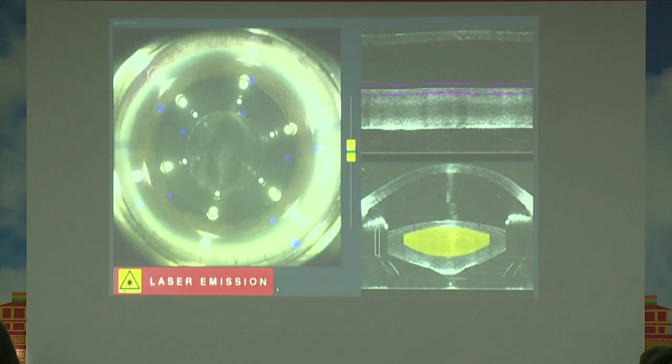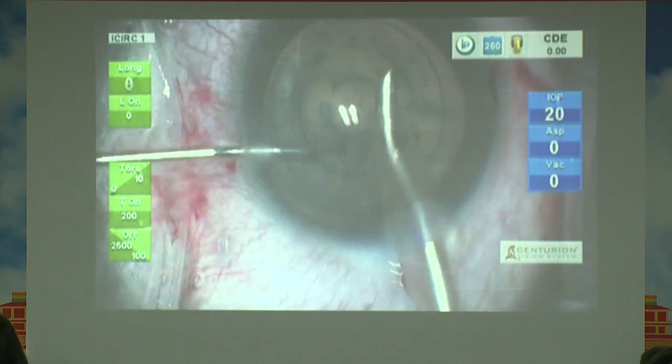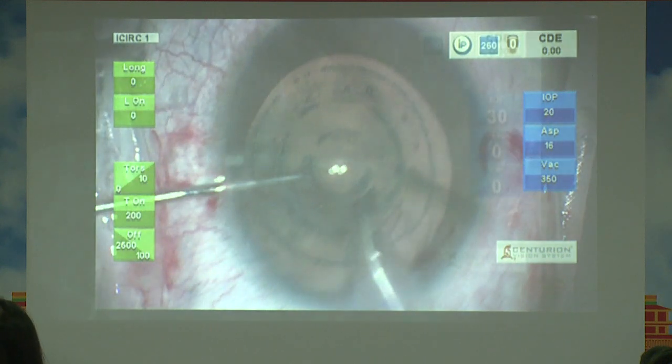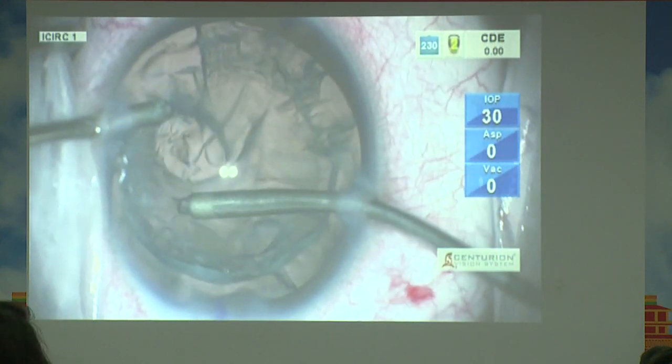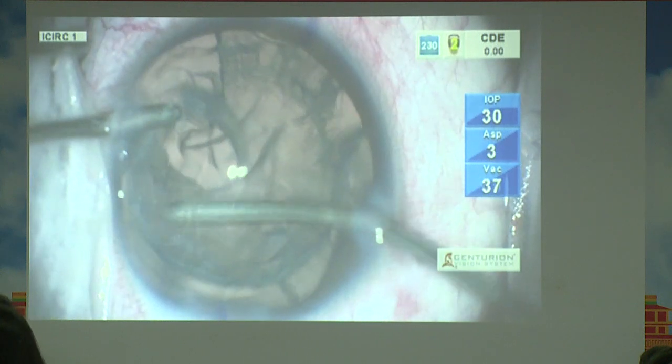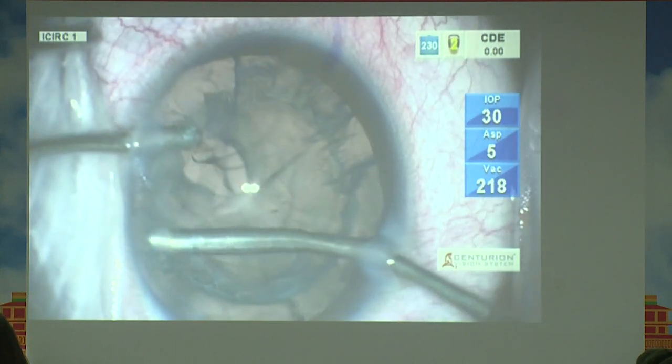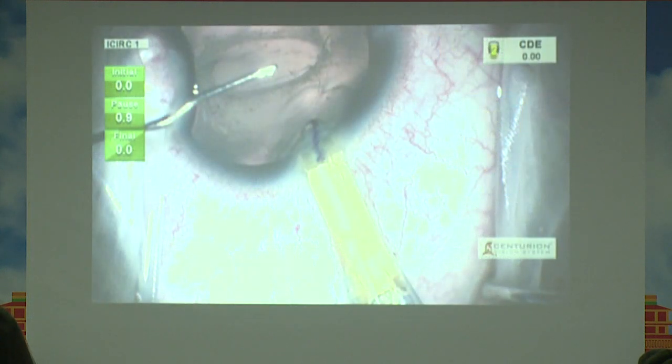So we use femtosecond laser in this to create a rhexis and to create rings so that we don't have to do any hydro maneuvers inside the eye. And I'm just going to move out of this because it's not the purpose of the talk. But once you make rings, it's easier to debulk the nucleus. And once you debulk the nucleus and use moderate parameters, particularly in eyes where you're able to preserve that PCR and not enlarge it and maintain the integrity of that PCR, you can put a toric IOL considering your bag is stable.